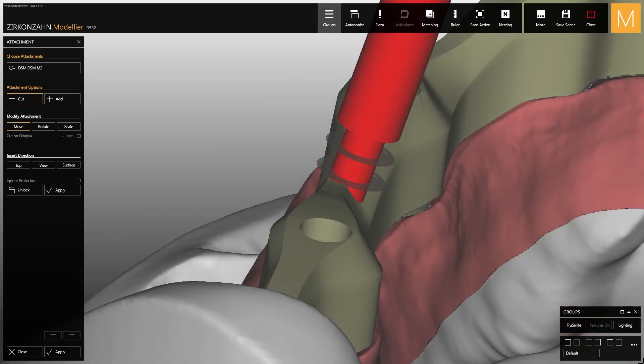If the attachment is placed too high, the thread in the bar won't be long enough to ensure stability to the secondary structure once screwed into the bar. If, on the other hand, the attachment is too low, the stop for the screw head in the secondary structure will be too thin and may cause fractures in the zirconia material.